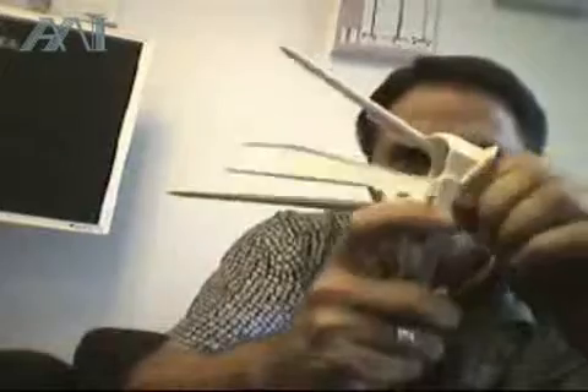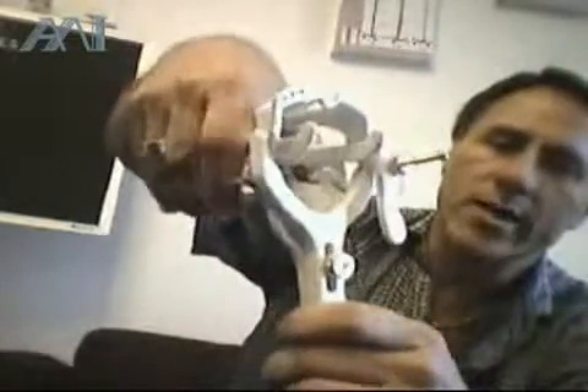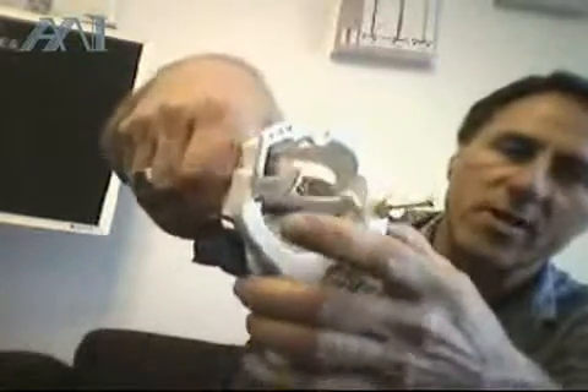Twist the handle into position like I'm doing here — the four blades are now activated. To show the process again: grab the handle, twist it into position, bring it down, touch the spring, and touch the other spring.